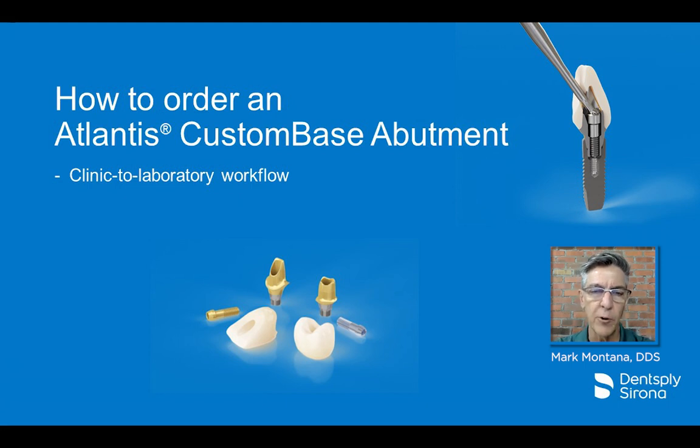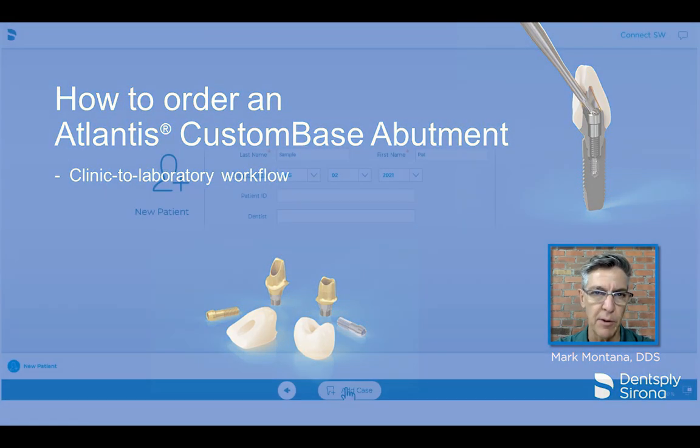Hello, my name is Dr. Mark Montana, and I'm going to demonstrate the workflow to order a Dentsply Sirona Atlantis custom-based abutment.